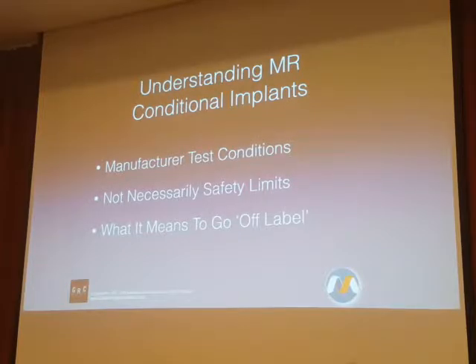By the way, if I do this, I just expose my entire body to 2.5 gravitational forces, G's, of acceleration when I landed. If I didn't dislodge my coronary stent when I did that, why is it going to dislodge if the deflection is 46 degrees horizontally? It's not.